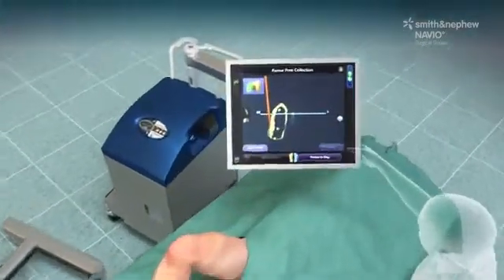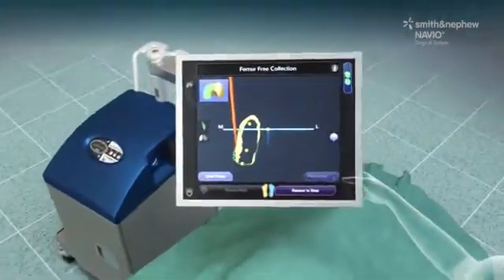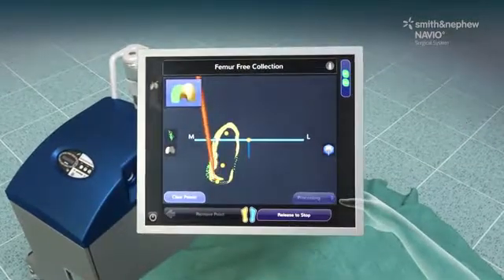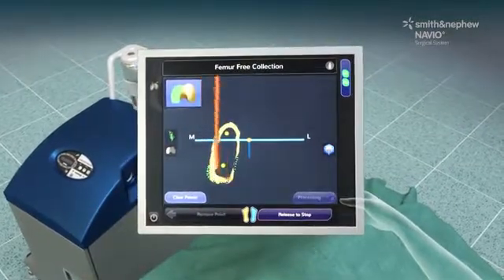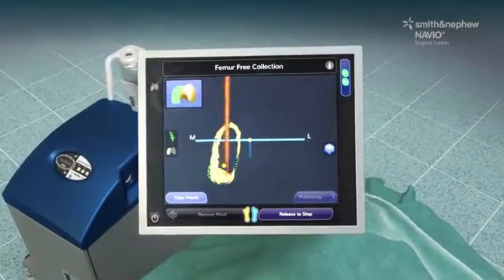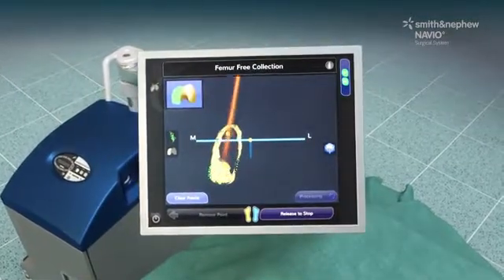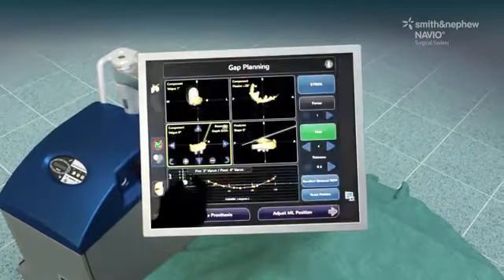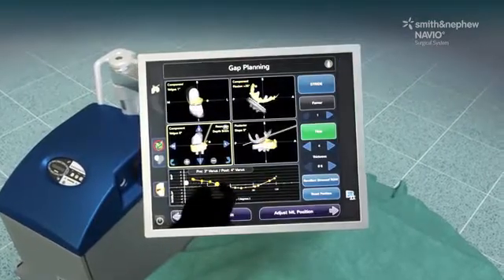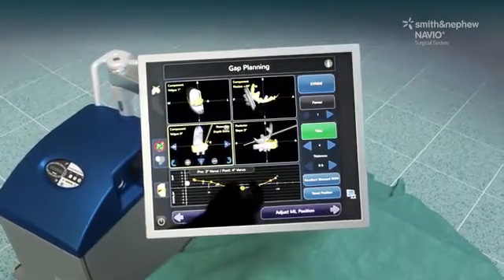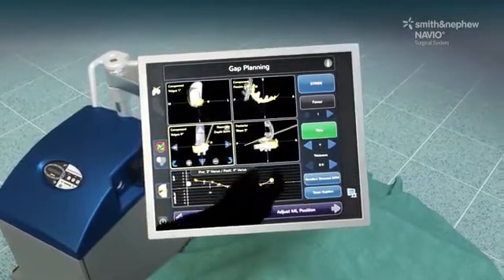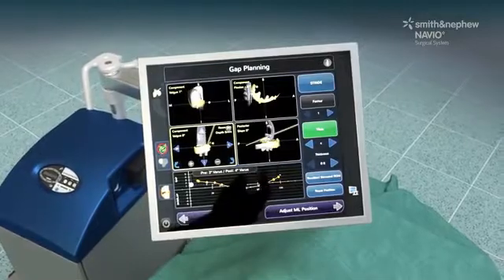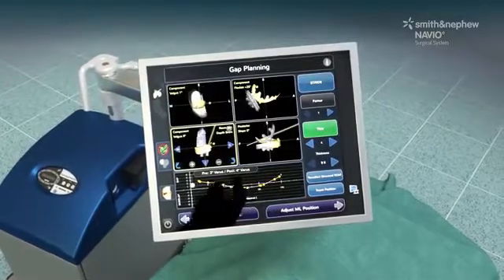The Navio surgical system has a small footprint that seamlessly integrates into OR workflows. Instead of a preoperative CT scan, mapping of the bone surface is done intraoperatively and is used to create a 3D representation of the bone structure.